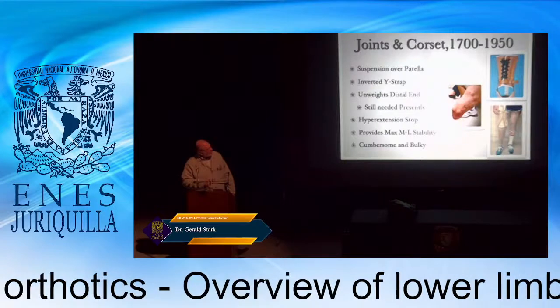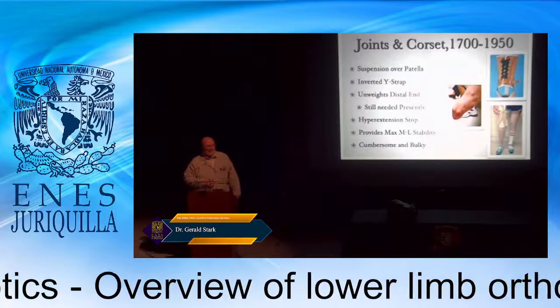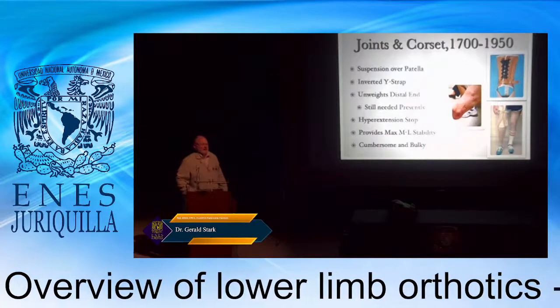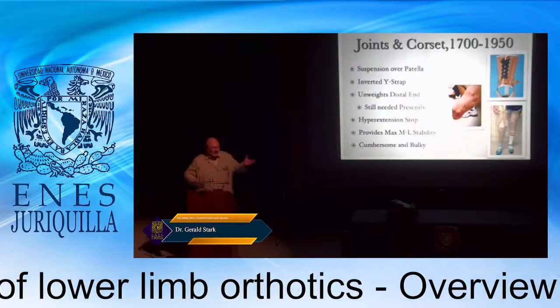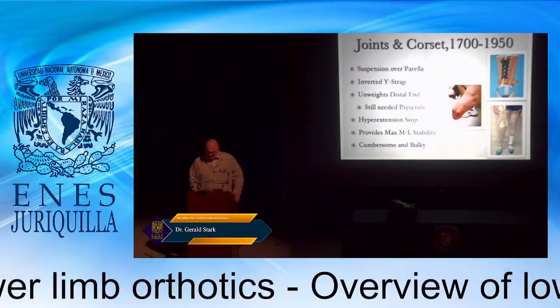The nice thing too, though, about the joint and corset is it had a hyperextension stop, meaning in late stage walking, the knee wouldn't hyperextend. And this is really important for very short limb lengths.